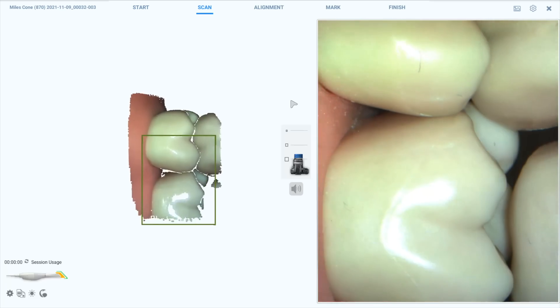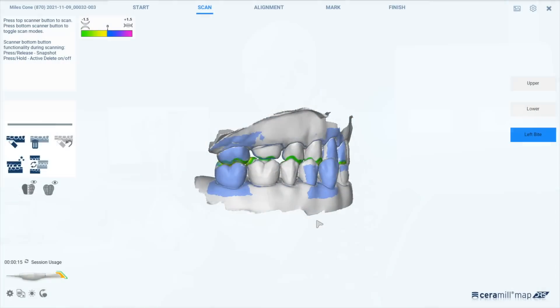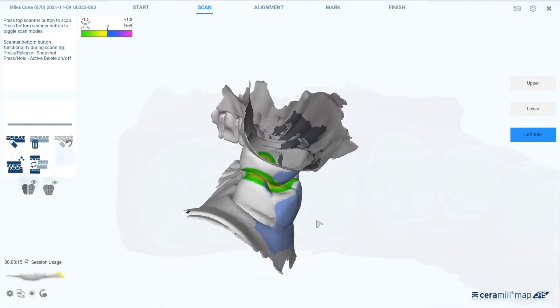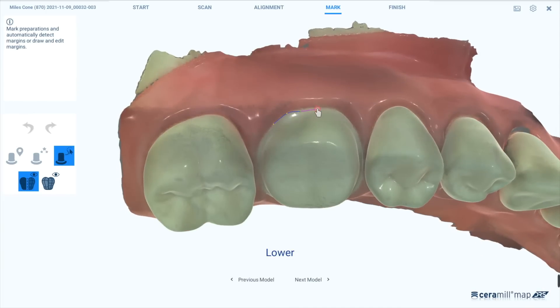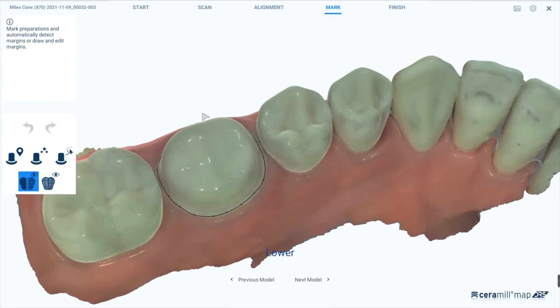Once we scan the upper and the lower jaw we will then scan the bite. The alignment and the contact points can then be checked afterwards in the software. It is possible to define the margin line in the scanning software, which could be of tremendous help for your dental technician if you decide to send the files to him or her.